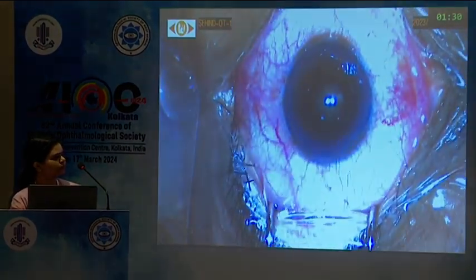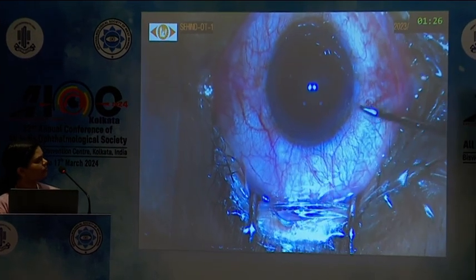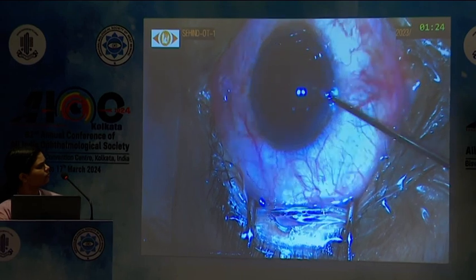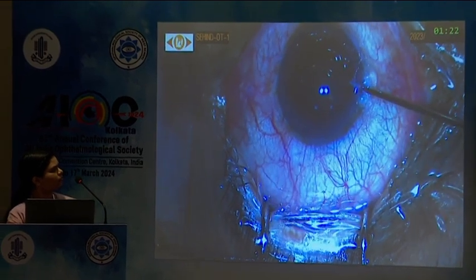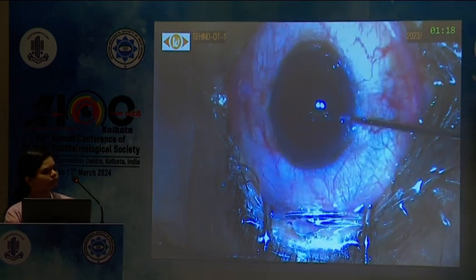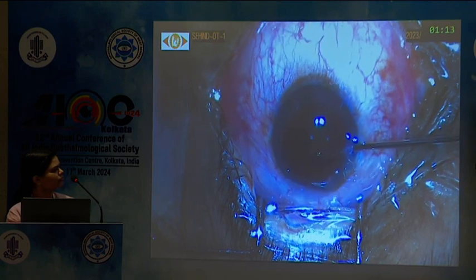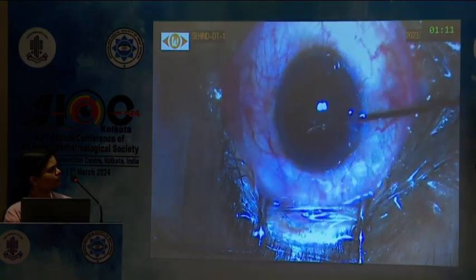This is case 3, in which the pupil is only 3 mm dilated. We first tried with the intracameral adrenaline, but the pupil failed to dilate. Our next resort was performing 4 quadrant sphincterotomy. So we fashioned 2 side ports in such a way that we made 4 sphincterotomies with the vitreous microscissors, equally spaced.